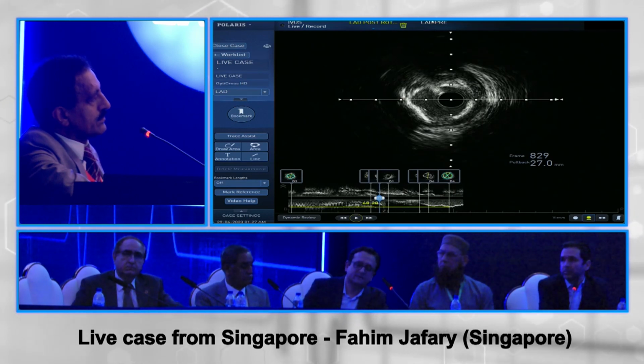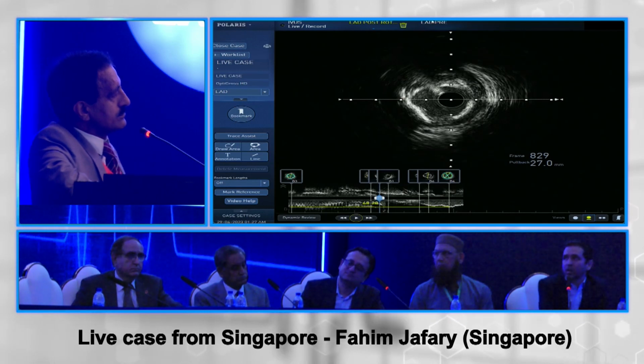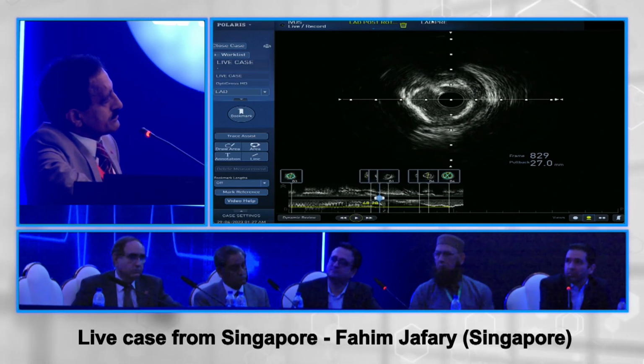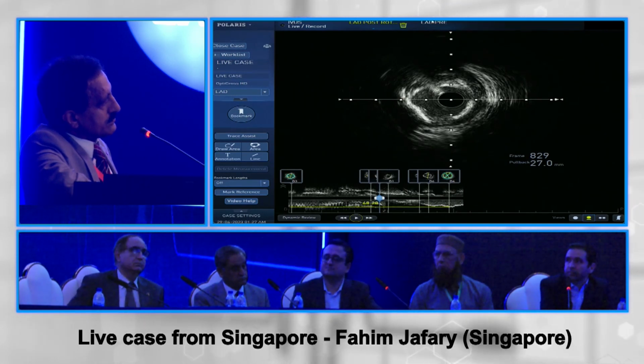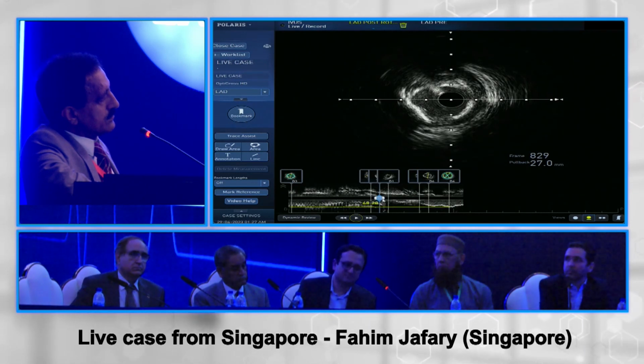But that is a fair point. Could we have gone with IVL instead? I guess it's always definitely something to keep in mind. Now Diana's shown you that after rotational ablation, we can see that there's some cracks in the calcium.